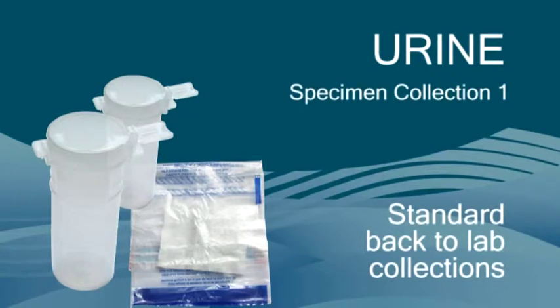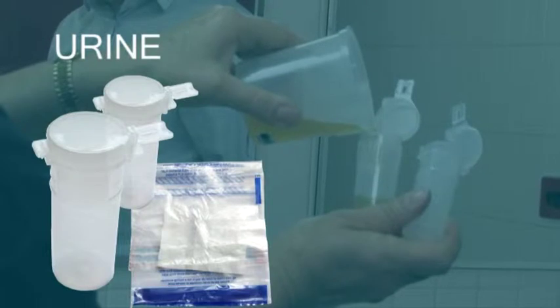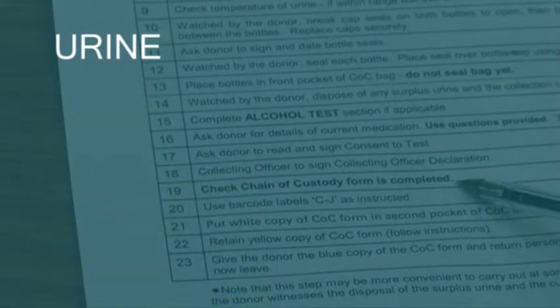Urine Specimen Collection 1 – Standard Back-to-Lab Collections. This section shows you how to collect urine specimens for drug analysis under Chain of Custody procedures.